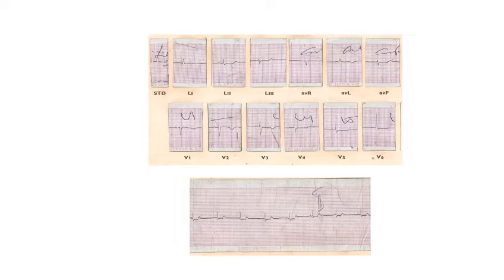What is the duration of the QT normally? QT is less than 460, 0.36 to 0.44. Sir, the QT should be half of the RR interval. So let us go for the corrected QT interval. The corrected QT is the QT divided by the square root of the RR interval. What is the normal upper limit of the corrected QT interval? 0.44. Okay, that's very good.